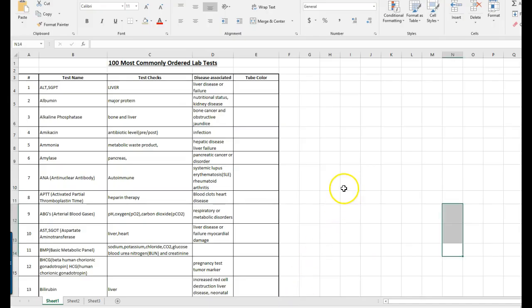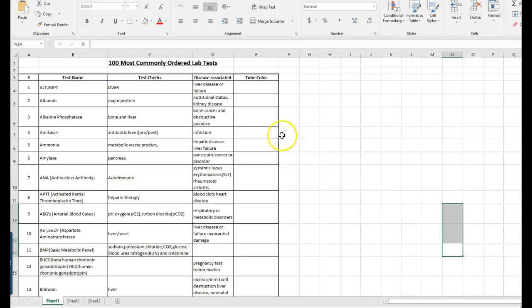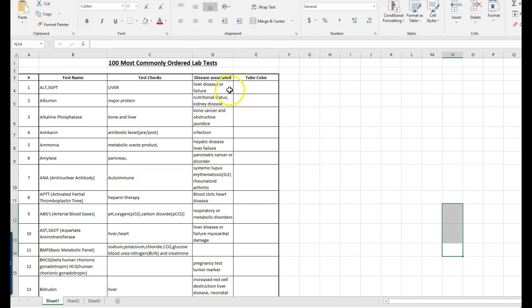Hey guys, so this is the overview for how to use the Quest Diagnostics test menu website for looking up your hundred most commonly ordered lab tests. Basically you are going to use the Quest website to look up the tube color that the lab test will be drawn in.